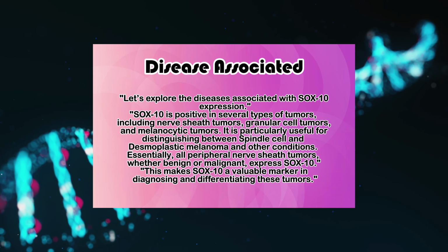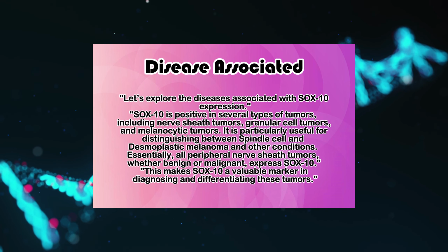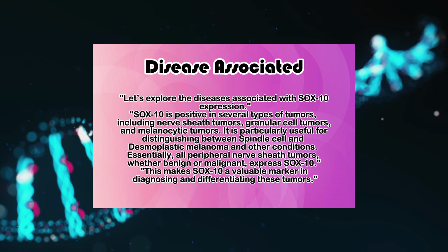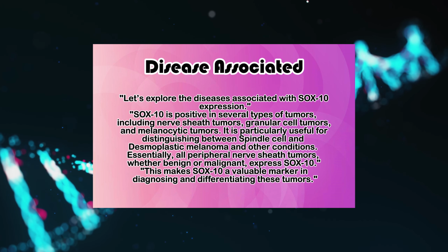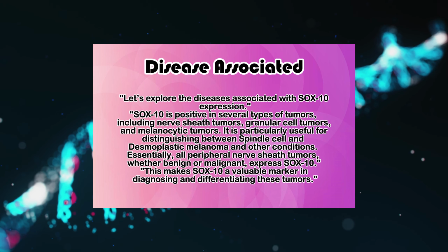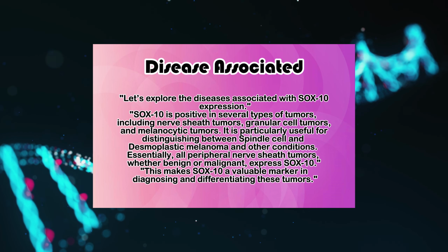Disease-associated. Let's explore the diseases associated with SOX-10 expression. SOX-10 is positive in several types of tumors, including nerve sheath tumors, granular cell tumors, and melanocytic tumors. It is particularly useful for distinguishing between spindle cell and desmoplastic melanoma and other conditions. Essentially, all peripheral nerve sheath tumors, whether benign or malignant, express SOX-10. This makes SOX-10 a valuable marker in diagnosing and differentiating these tumors.